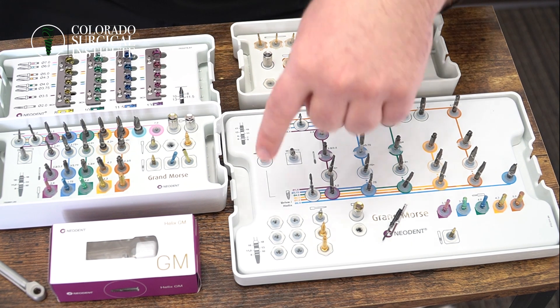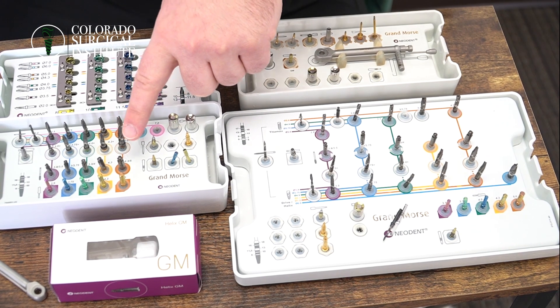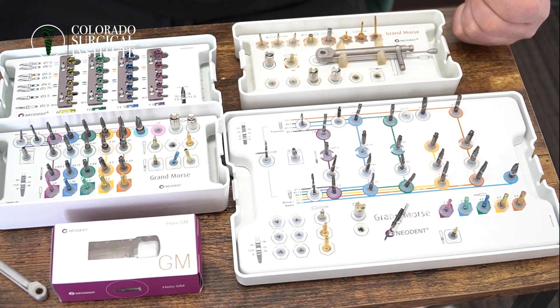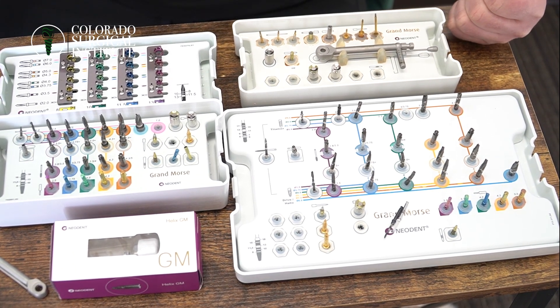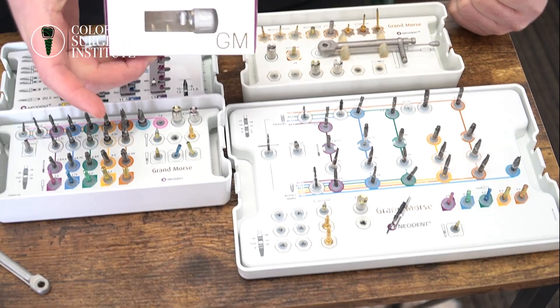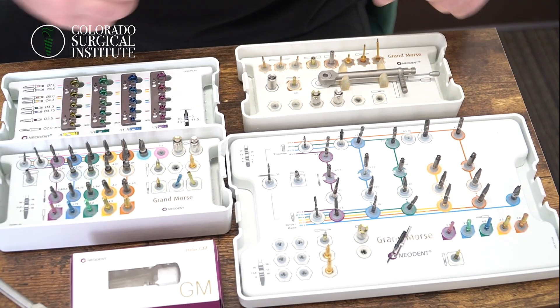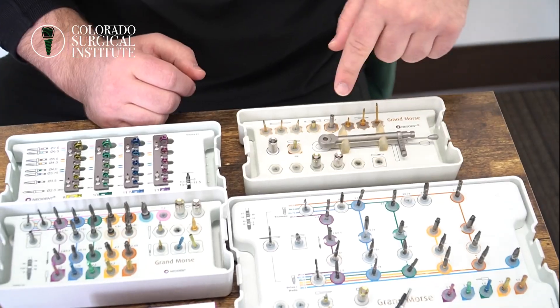I do encourage everyone to have two different kits — the full kit and the compact kit — just so you have an entire selection of pieces to use. For everyday implant placement, more than 95% of the time we are using Neodent's Helix implant. That's pretty much a universal implant to use. What's cool about Neodent in general is just the selection of sizes of implants.